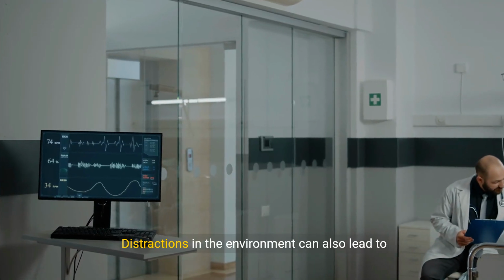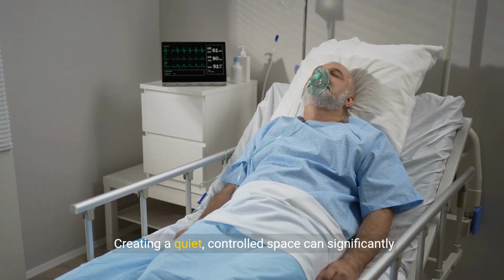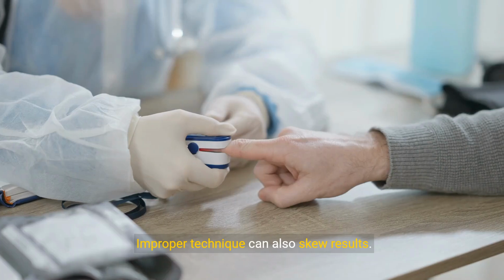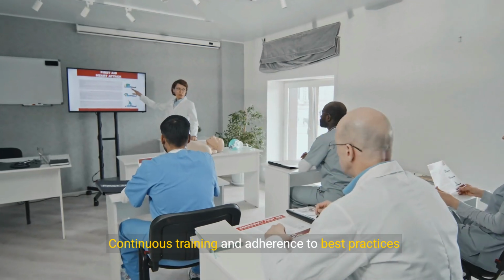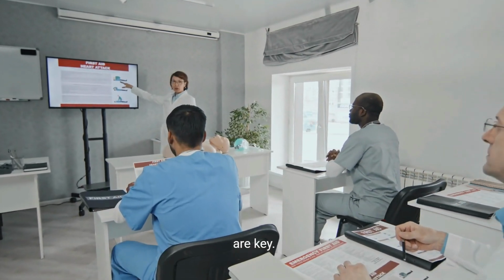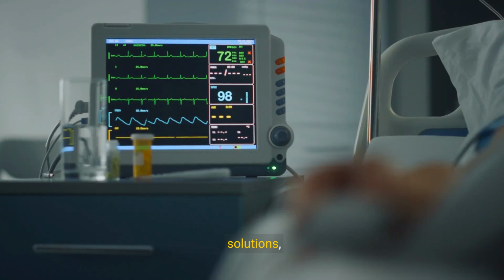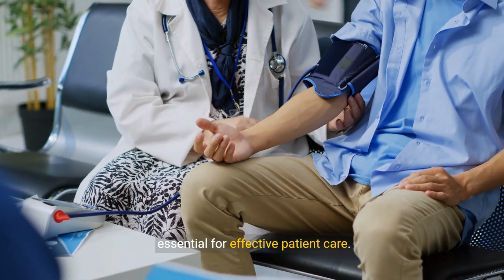Distractions in the environment can also lead to errors. Creating a quiet, controlled space can significantly improve measurement reliability. Improper technique can also skew results. Continuous training and adherence to best practices are key. By recognizing these issues and implementing solutions, we can maintain the high standard of accuracy essential for effective patient care.